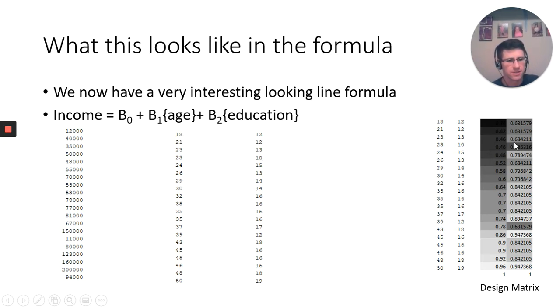What I did over here was actually just grayscale it, because a lot of times you'll see these actually done in black and white, and you can clearly see two columns. And the first one is just slowly increasing over time. The other one kind of oscillates. And you can see the oscillations much more clearly because the little dark rows are the oscillations. So here's a nice divot and here's a nice divot. But then it kind of peaks and valleys and all that. So if you can think of it, these are kind of individual components, and they're individual parameters in this case.